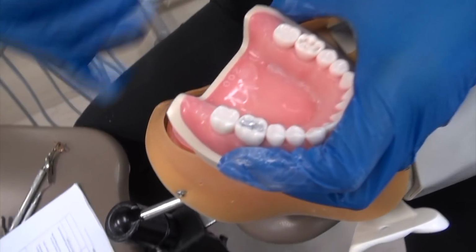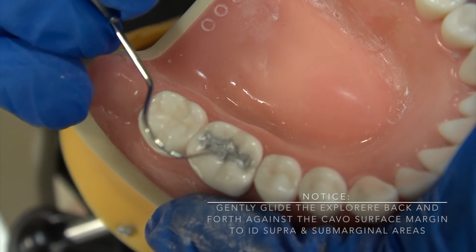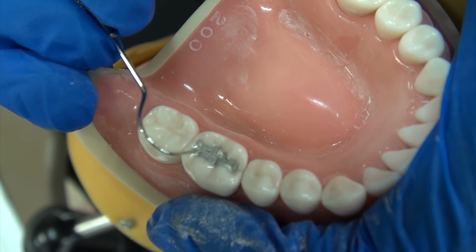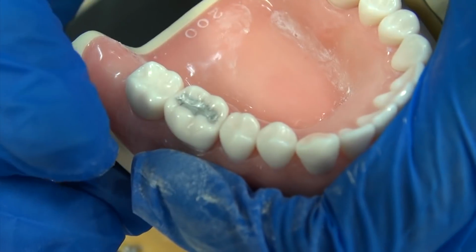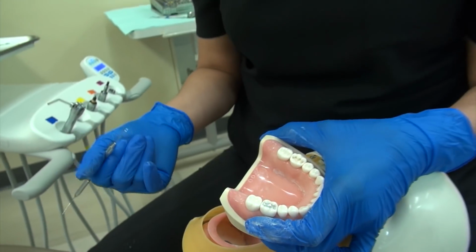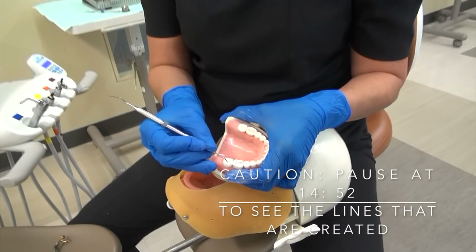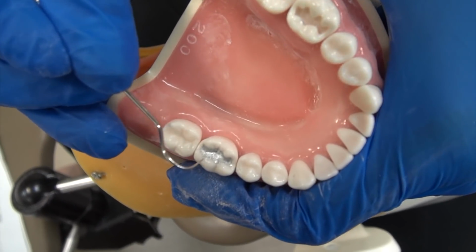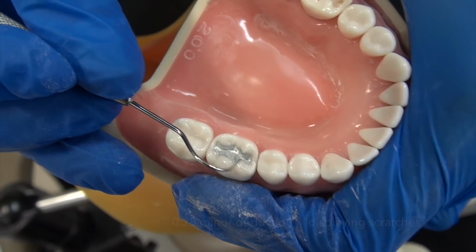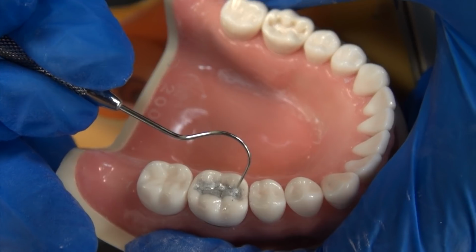The other aspect is, as you're practicing, you want to be able to identify what it means to have flush margins. So you want to be able to go through and start developing your eye. And see how I'm rubbing the preparation? This is something that you can do while you're practicing, because you can also start learning to identify what submargination, supermargination is. You don't want to do this too much on the day of prep, on the day of your progress assessment, because if you look closely, you can actually see those lines from where I drew my explorer. See how you can see those faint lines? So you don't want to have that accessory, distracting margins there. Also, be aware of your fossas. It's really easy to submarginate in here.